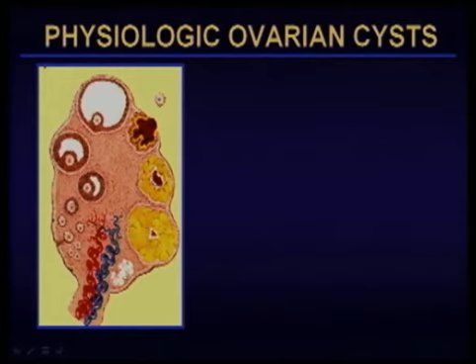Whenever I do a gynecologic scan, I always ask the patient two questions. One, when was your last period? And two, are you on hormones? Because I want to tie what I see on the ultrasound exam to what her responses are relative to where she is in her cycle.